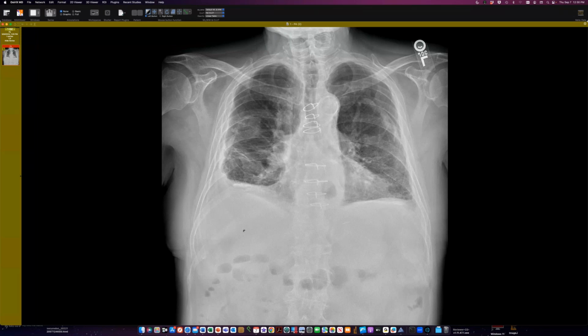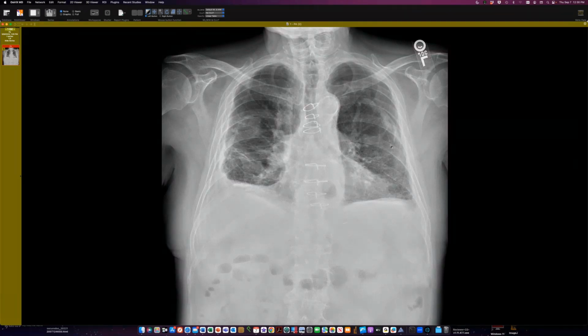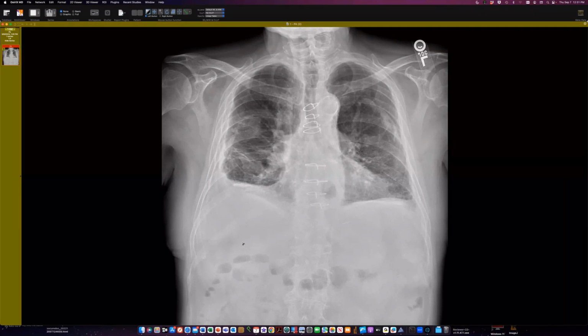Okay, the interlobar fissures, David, may be extensively involved, or are we just seeing what is going up here that's tracking the fissure? Maybe that's part of the diffuse pleural thickening rather than plaque. It'd be nice to have a lateral view and it'd be nice to have CT, but I don't have that on this case. Okay, so that's an occupational case.